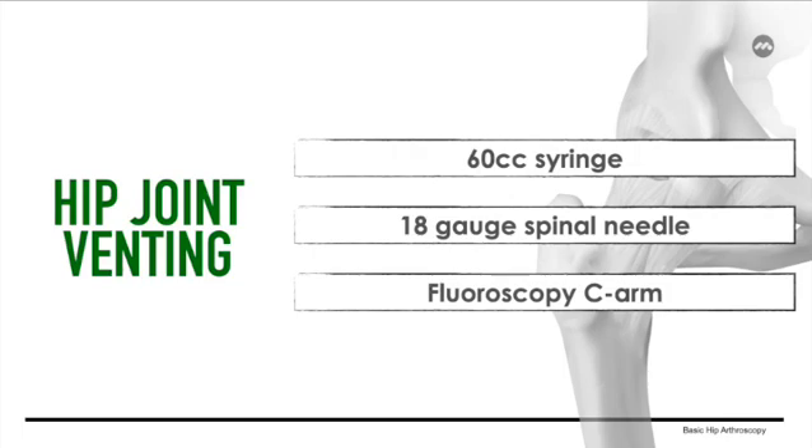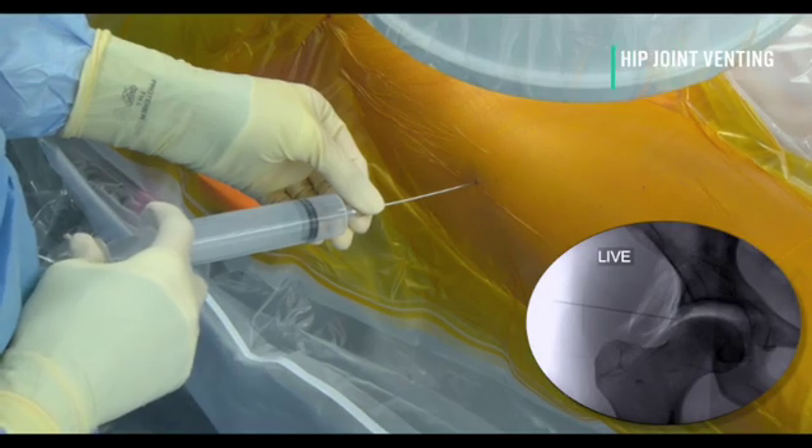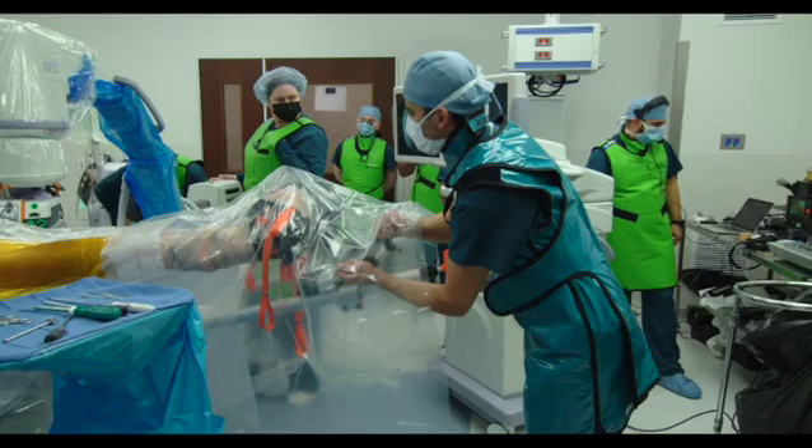Sterile draping is followed by disruption of the hip's native suction seal by performing an air arthrogram. A 60cc syringe, 18-gauge spinal needle, and fluoroscopic C-arm for adequate access verification are required for this step. A spinal needle is then used to perform the air arthrogram, allowing disruption of the hip's native suction seal while achieving an additional centimeter of distraction.